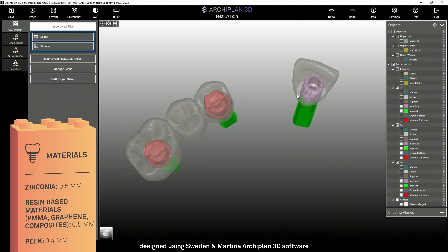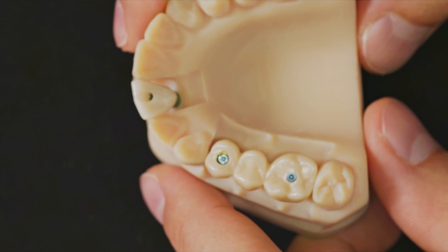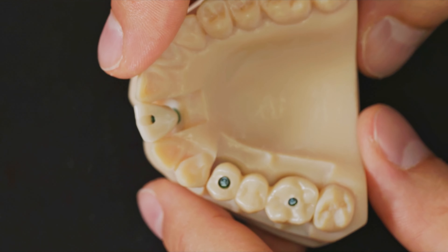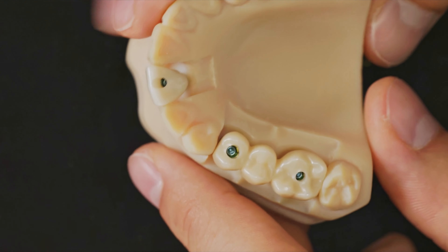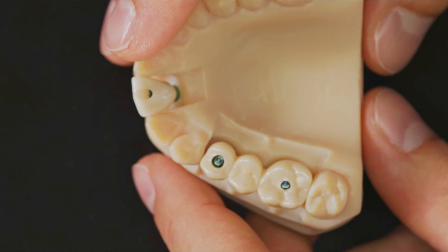Obviously, it's not possible to change the cement space between the T-Base and the crown, because it is imposed by the library. Once the modeling has been completed, it's possible to mill the structure in-house if you have a milling machine, or to send the file to the Sweden and Martina milling center ECO through our portal.